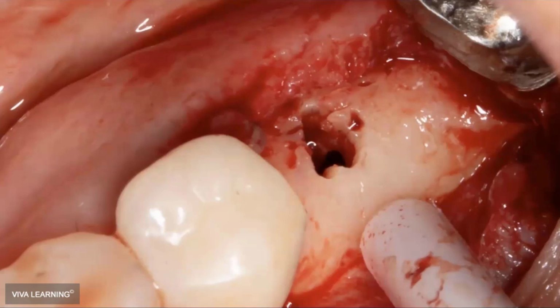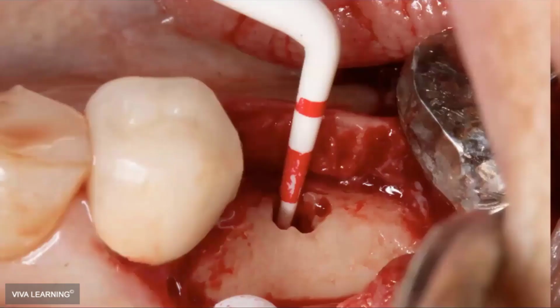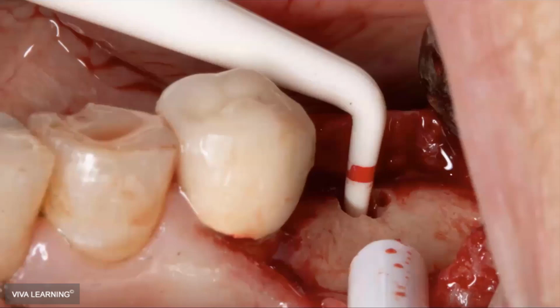This is one of the random photos in the middle of the surgery. You can obviously see it's a laser. It's a little more erratic of a cut. It's not going to be perfectly cylindrical like a burr would be. There's a lot of measuring that takes place, like a lot.